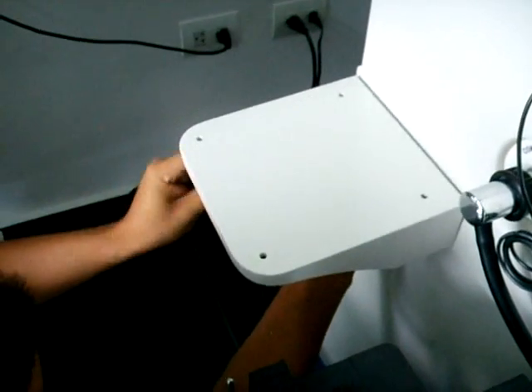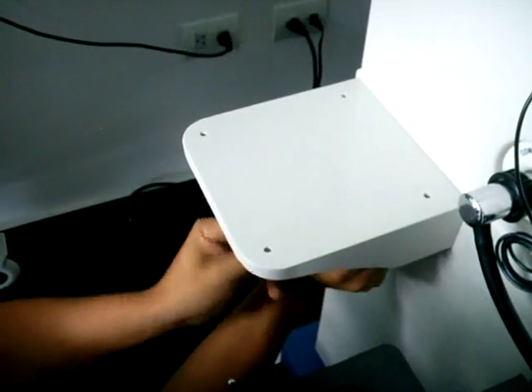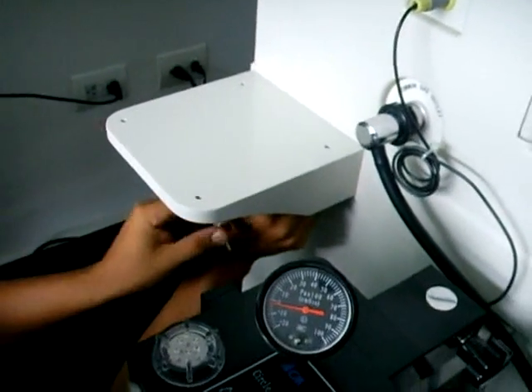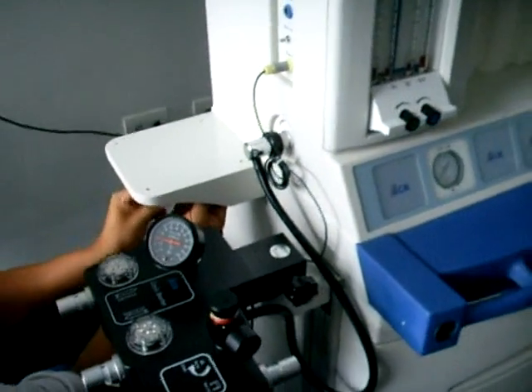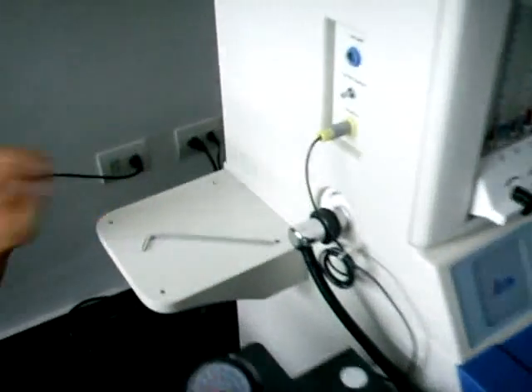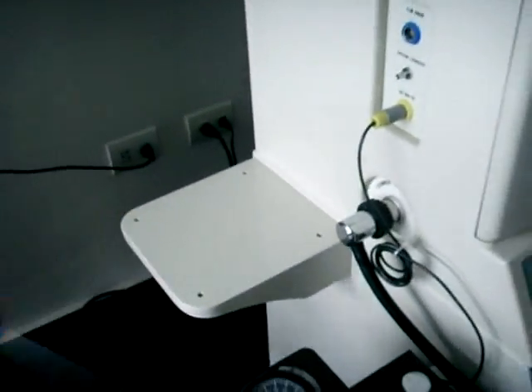De igual manera como lo hacemos con el primer tornillo, lo hacemos con el tornillo número 2, número 3 y número 4. Es importante tener en cuenta que la forma como vamos a adherir estos tornillos es por medio de la herramienta que trae la máquina de anestesia consigo, la llave Allen, como se observa en el video.